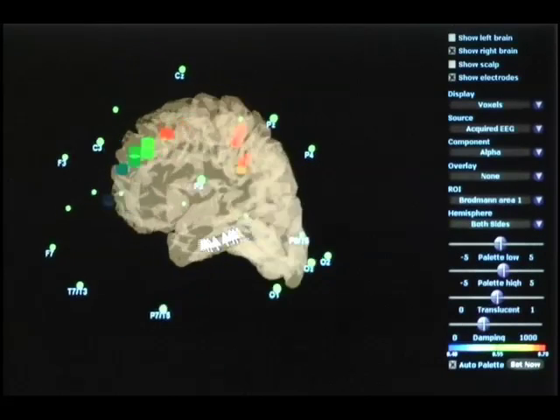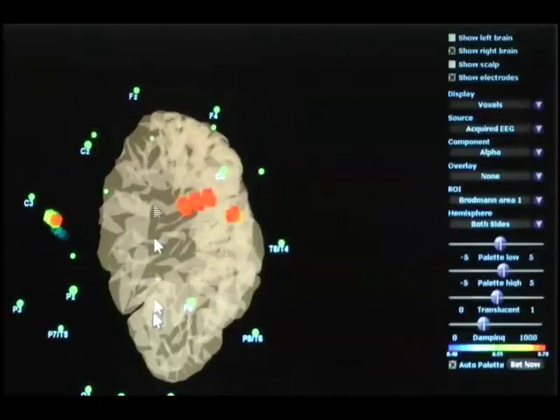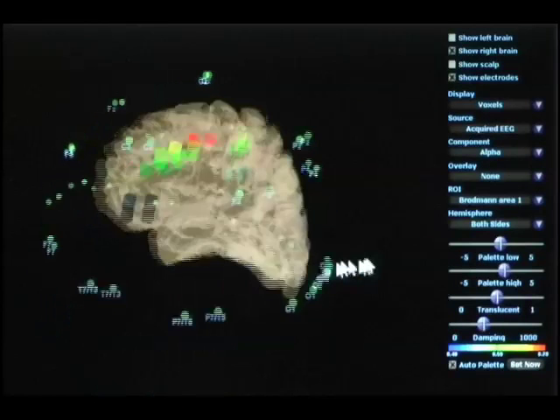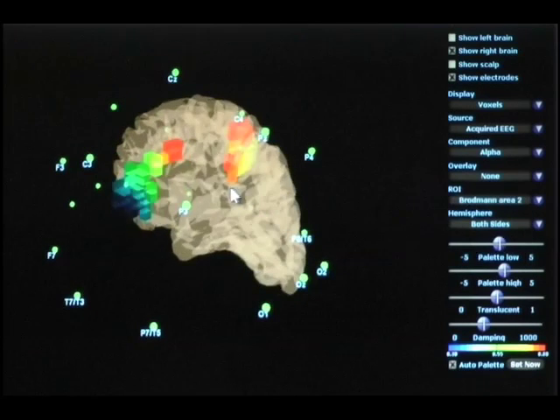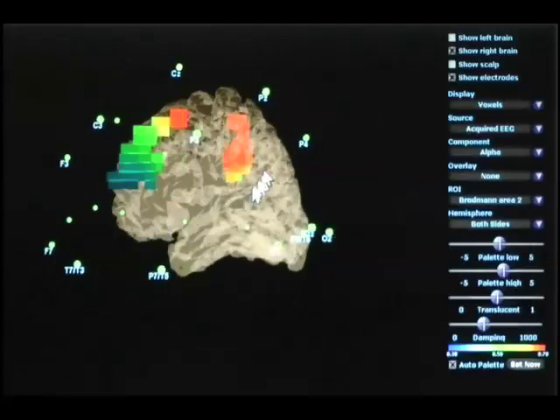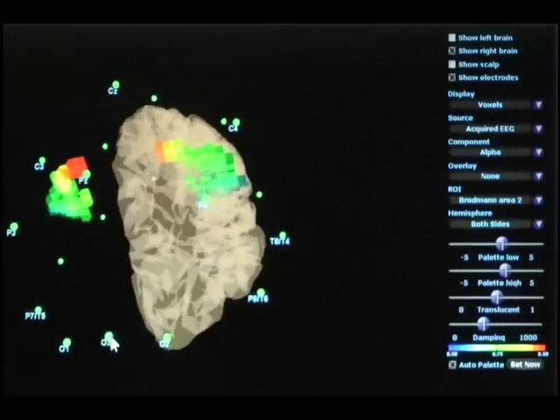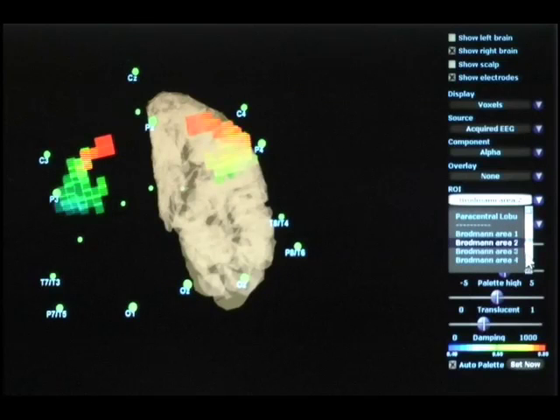This, for example, would be Brodmann area 1 in the vicinity of motor processing and sensory information. Then we have Brodmann area 2, motor strip activity. Again, we see more activity on the right than the left.